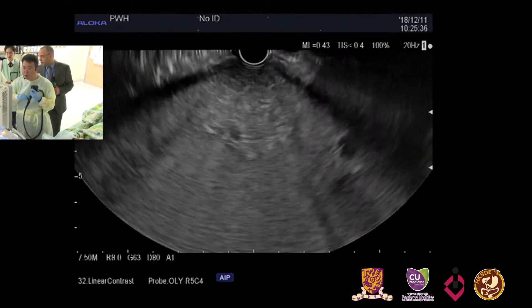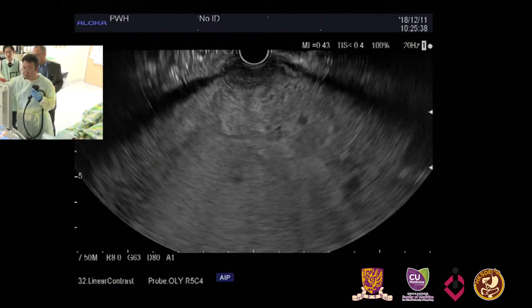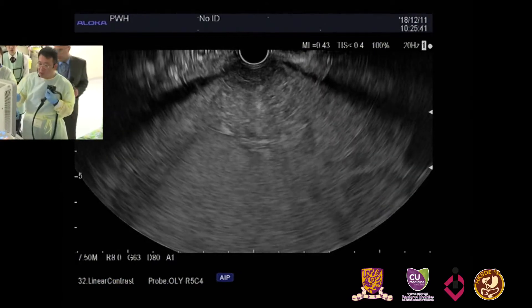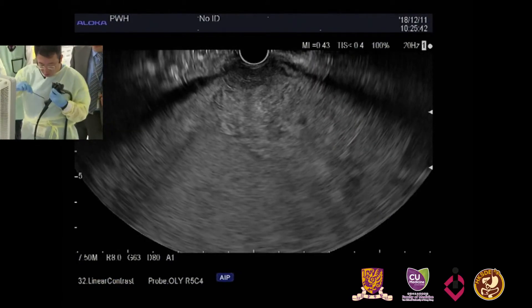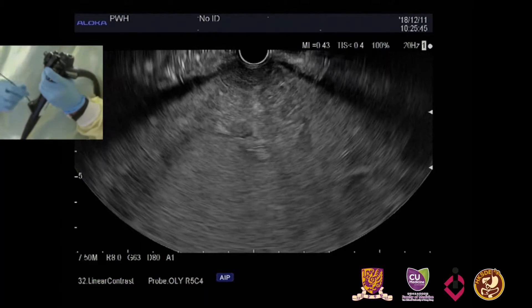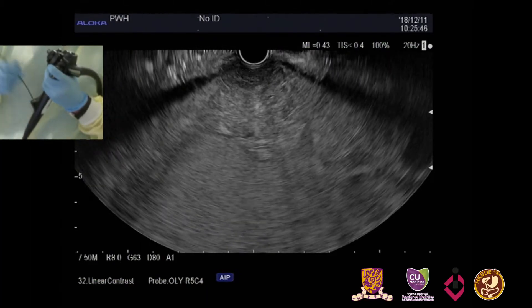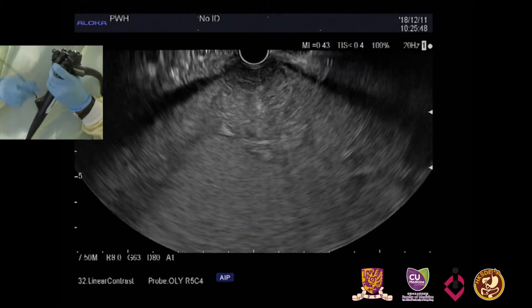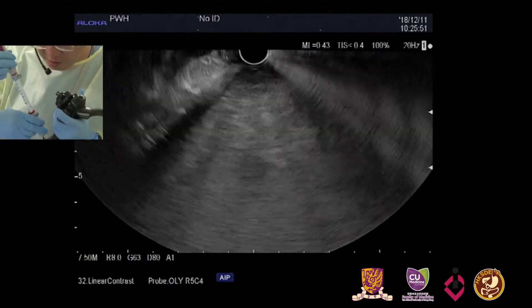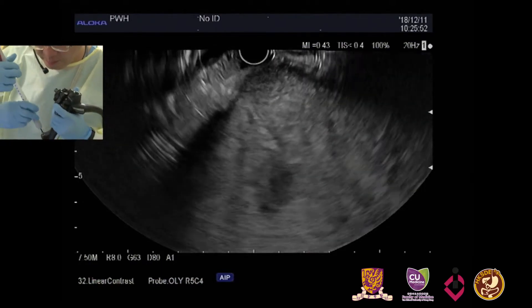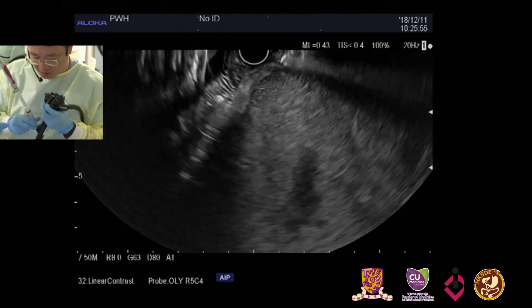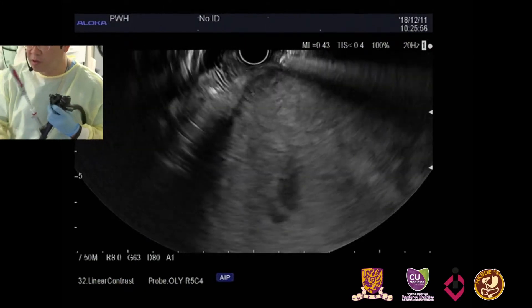If there are no questions, we will start to get tissue. Today I am using a 20-gauge needle to obtain larger tissue fragments. I will not use suction because the mass is bloody.